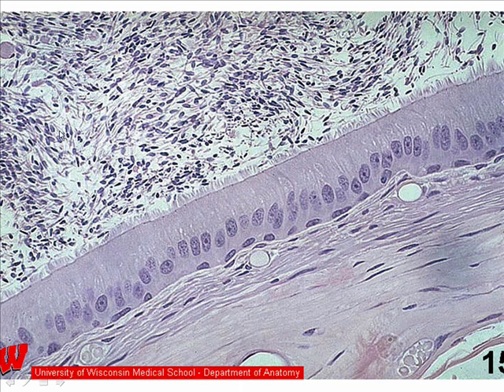In the lumen, you will note there are somewhat unusual cells in appearance, and these are actually maturing sperm. This is part of the epididymis that you'll learn about in the spring as we study the male reproductive system. And these portions of these cells, or defective cells, as well as fluid and other things, can be resorbed by the pseudostratified columnar epithelium.